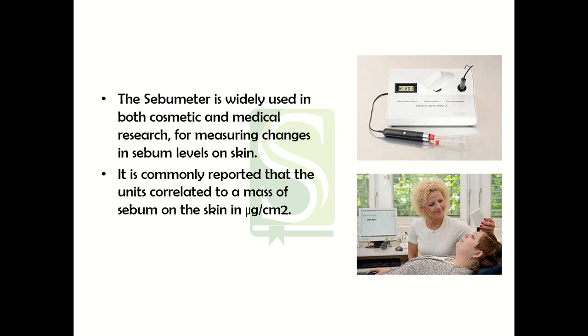Now, what is the use of Sebumeter? A Sebumeter is going to help you to determine the amount of sebum which is present on your skin. It is commonly reported that the units in which the sebum will be reported on the skin are correlated with the mass of sebum on the skin in microgram per centimeter square.